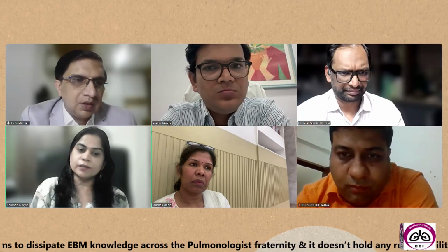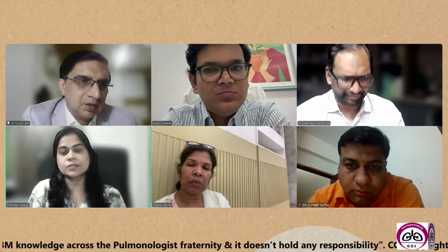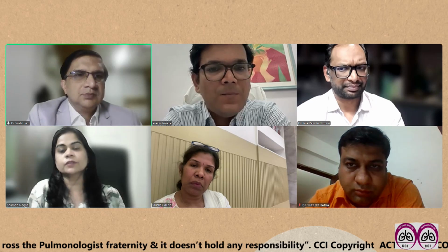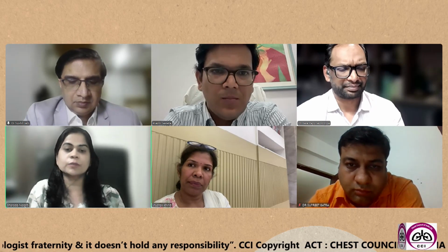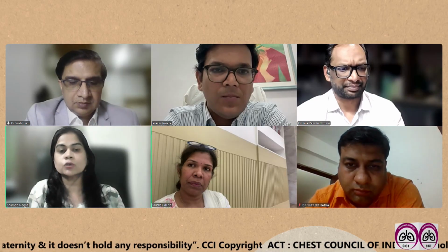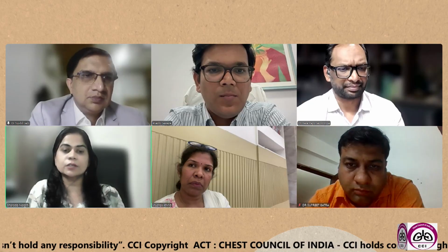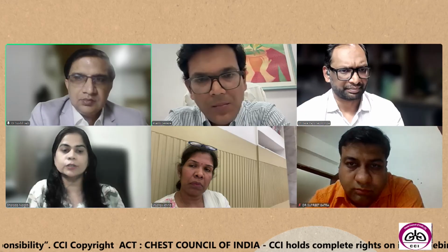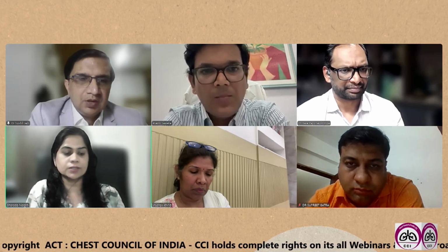Yeah. So I recommend doing cell block in all the scenarios, because the first thing is it helps in diagnosis. It helps in typing of the malignancy. It helps in doing immunohistochemical analysis and also molecular testing. So cell block has a lot of advantages. It increases the diagnostic yield, and it can be used for all these ancillary testing apart from diagnosis. So I recommend doing cell block in all situations. That is the first answer.